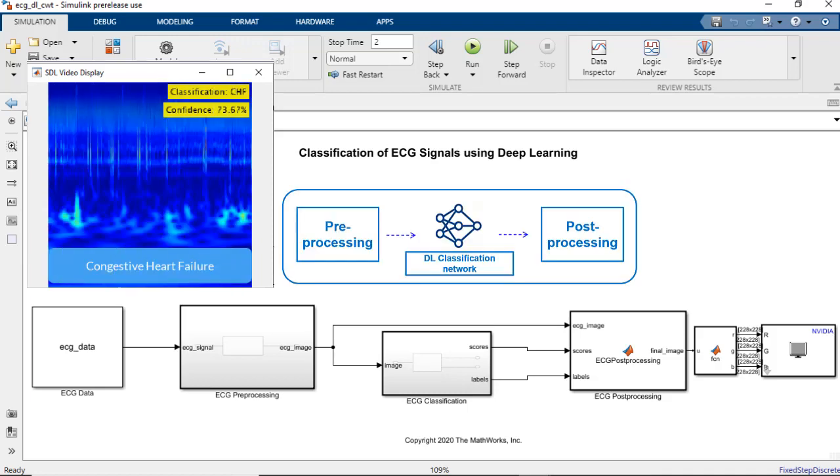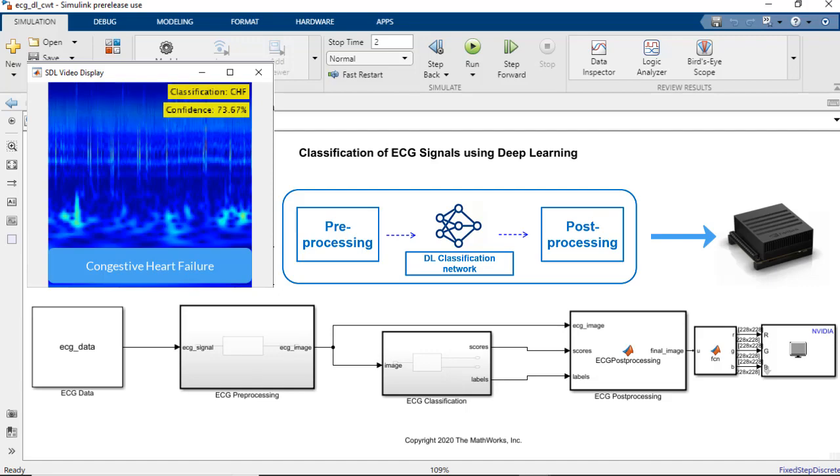We perform this classification using a pre-trained deep learning network in Simulink, and then generate and deploy the complete application to a Jetson board.